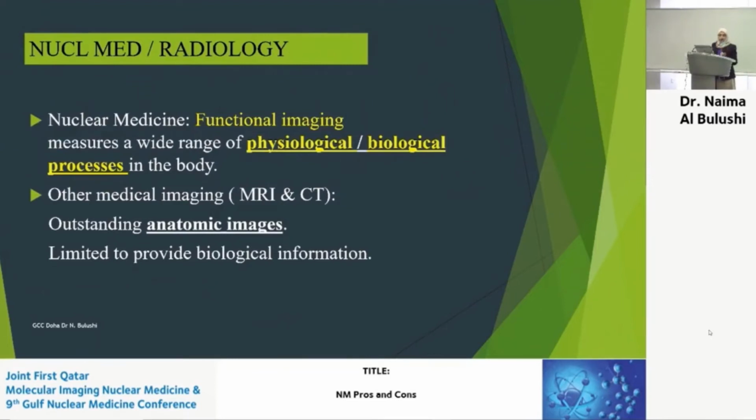So the first slide is something that I've used before, the differences between nuclear medicine and radiology. And again, I mentioned we image physiology and biological processes, and the medical imaging, meaning CT and MR, does the anatomical images. Having said that, as mentioned before, we do have some anatomical images with the hybrid imaging, and they do have some physiological imaging as well.